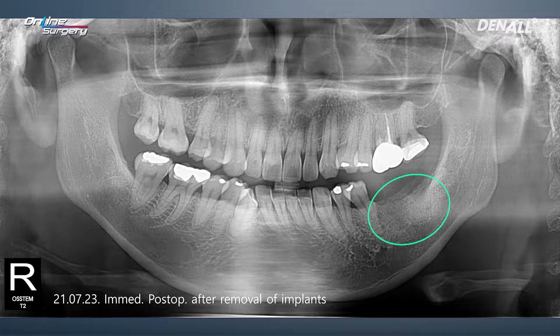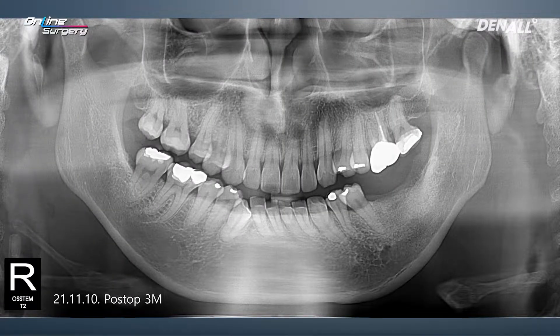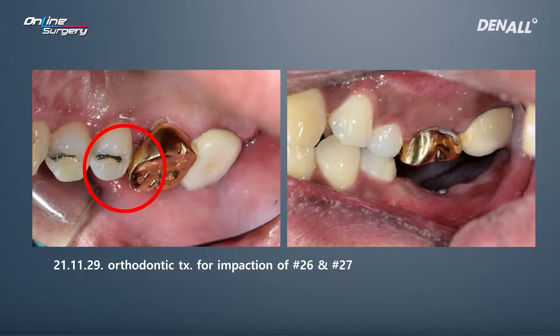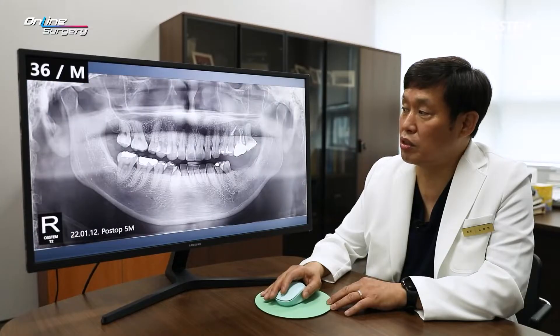This is the immediate post-op CT, number 37, and this is after three months. During that period, I noticed that the upper teeth were extruded due to prosthodontic reasons. I used an anchor screw to intrude these teeth, and intrusion was done about five months later. Somewhat successful intrusion was achieved, and therefore implants were to be placed.